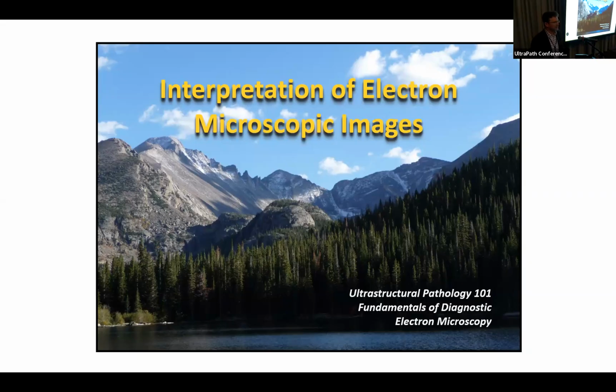And we recognize that there's places where electron microscopists can go and learn the technical skills that they need to become an electron microscopist, but there's just not very many opportunities to really learn about how to interpret electron micrographs. And so that was really the point of this curriculum that we put together. And since then, it began in Colorado a couple times. We hosted it in Estes Park at the Stanley Hotel, if you know that beautiful hotel there in the mountains.